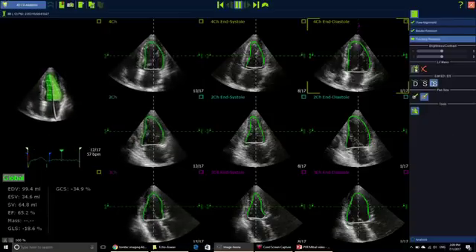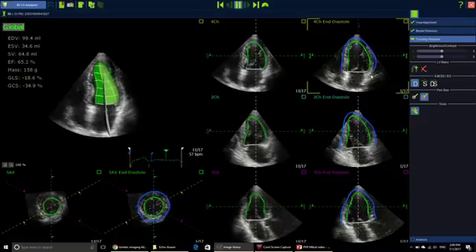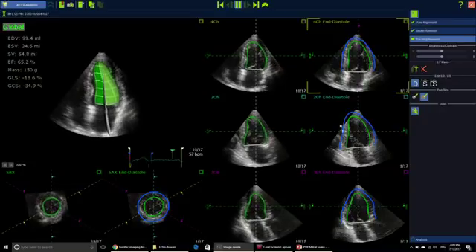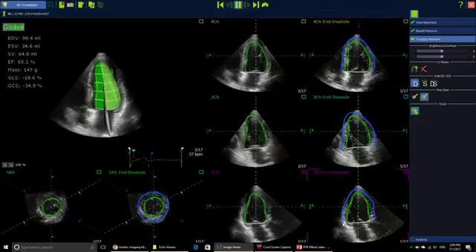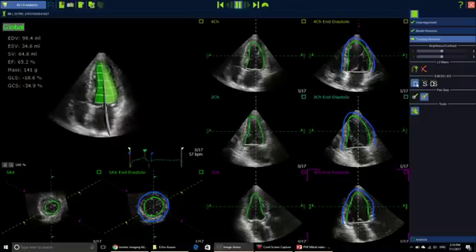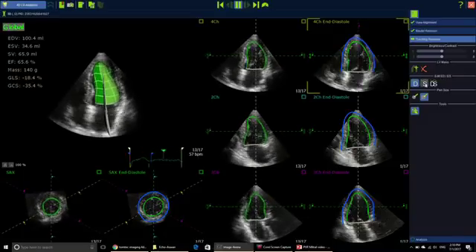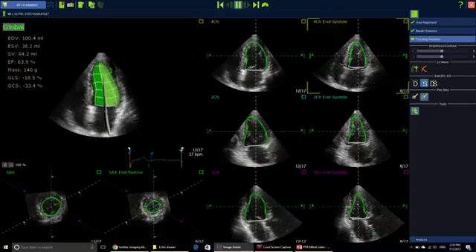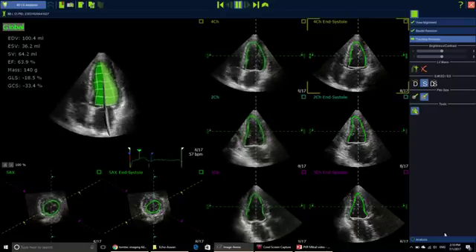If you need to calculate the mass, you click 'Calculate Mass.' It will give you another layer so you can place it outside the wall — you can also edit here. You need a full contour; my volume was not including the full contour of the LV, so it may not be ideal for that, but if you need to get the mass you have to capture the whole contour of the LV. You can also edit the diastolic and end-systolic contours here. When you are happy, click 'Analysis.'